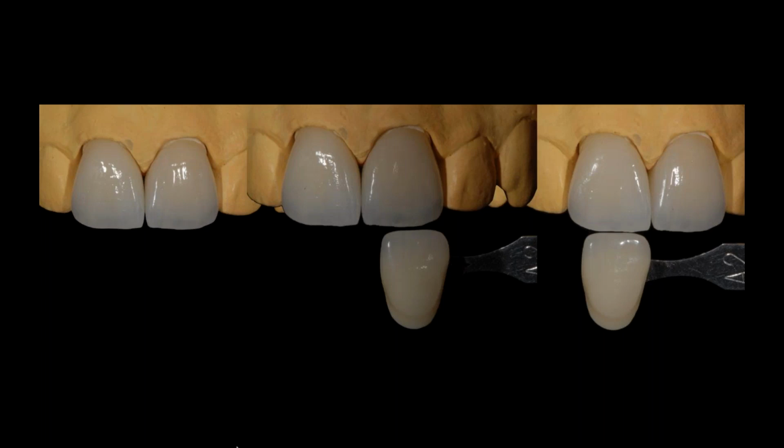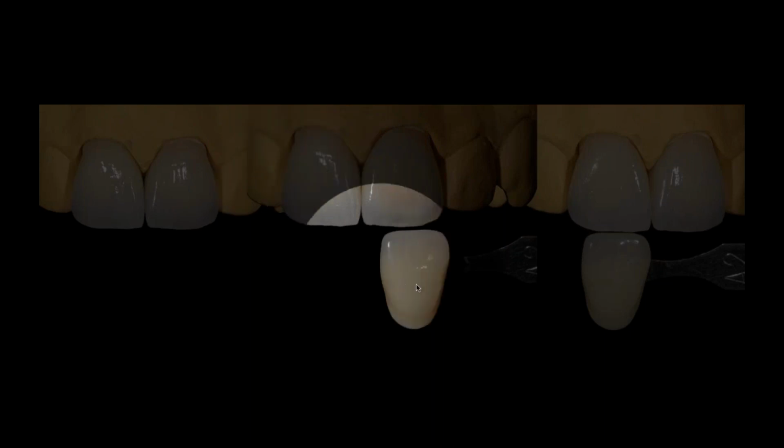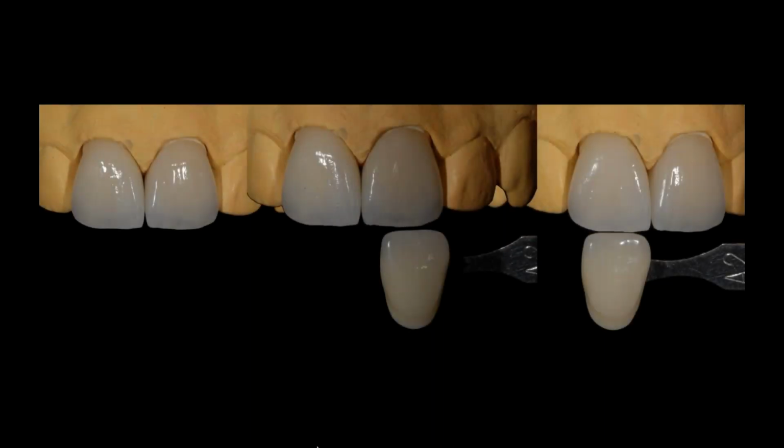So in the end, look at the difference, an A2 tab next to my restoration. See how it looks like a nice A1? It has all the value and chroma and brightness that I want, yet the value never drops. And it doesn't drop mostly because I supported the value with the chroma inside.